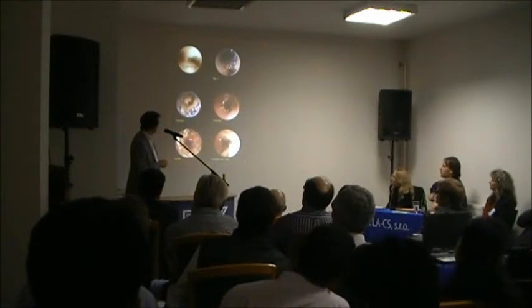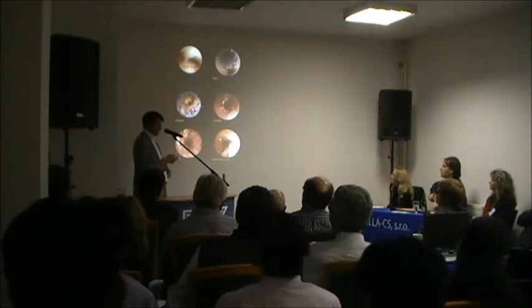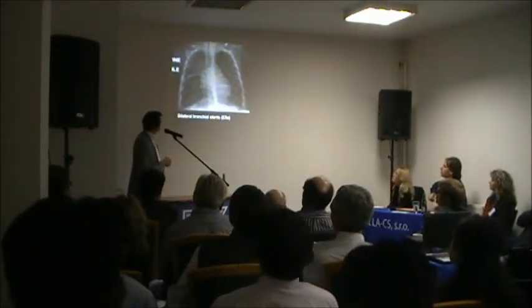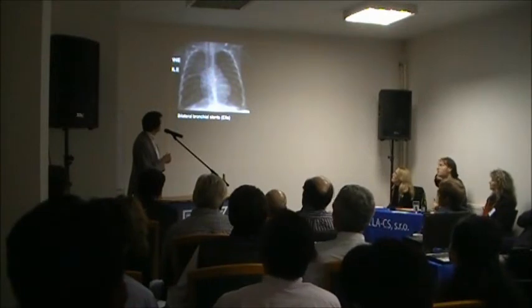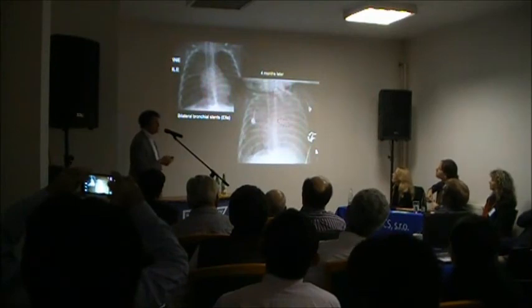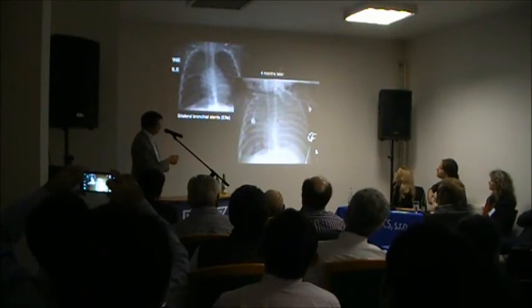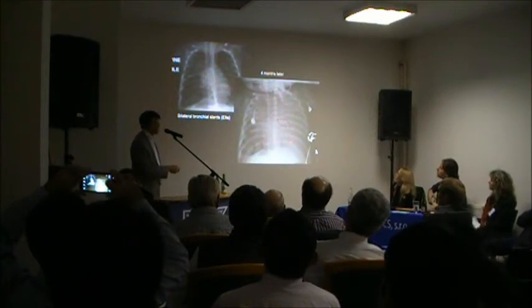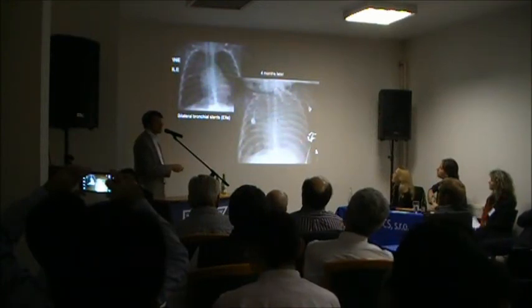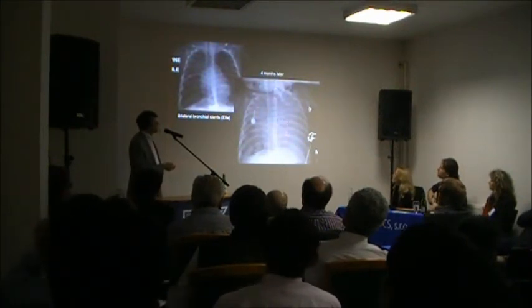We can still see the grids. And then literally 1 week later, the stent collapses and the markers are gone. Just to show you what it looks like, there's the 2 stents with the 2 markers. And this is what happened. We bronchoscope these kids quite often, so at 4 months, the stent was fine. The next day, these markers disappeared down the bronchus and the lung collapsed. The child ended up very sick, back on the ventilator, needing lots of help and support, and we had to go and put the second set of stents in with a patient who was quite sick.